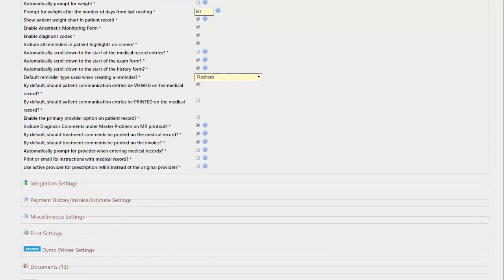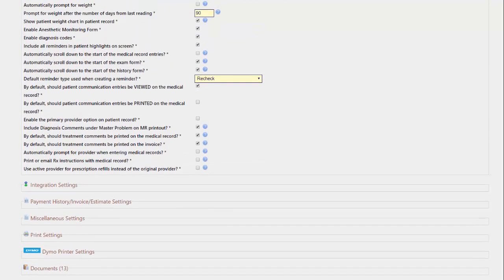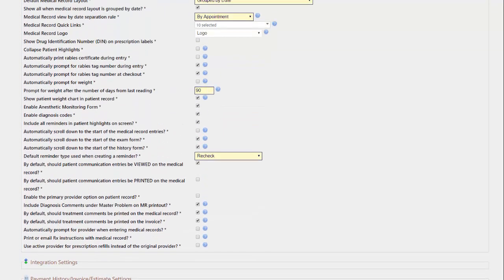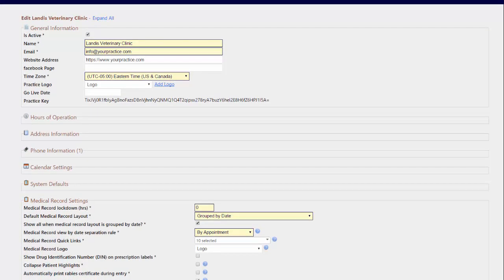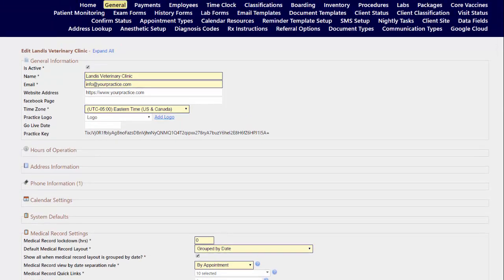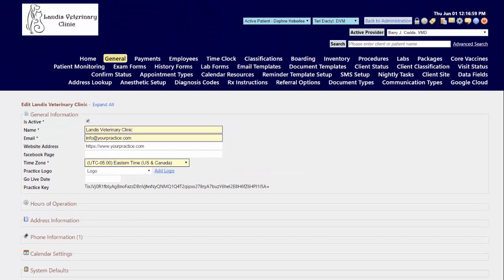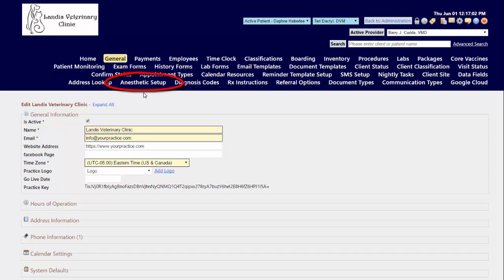To do some customizations for presetting the anesthetic monitoring form feature, once it has been enabled you're going to see a new menu option called anesthetic setup.